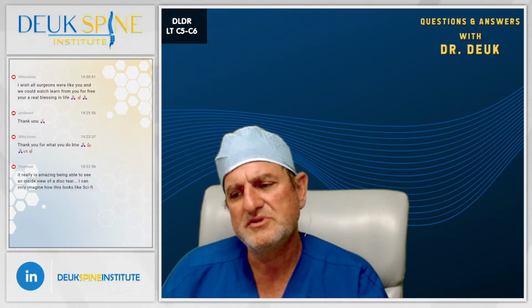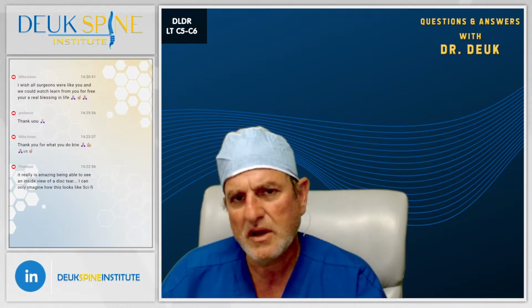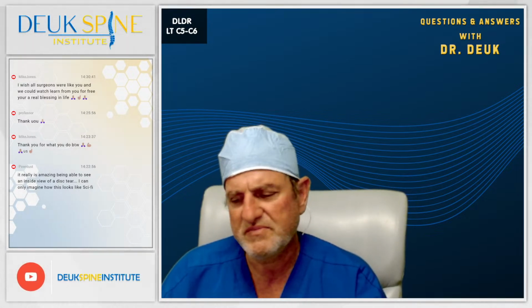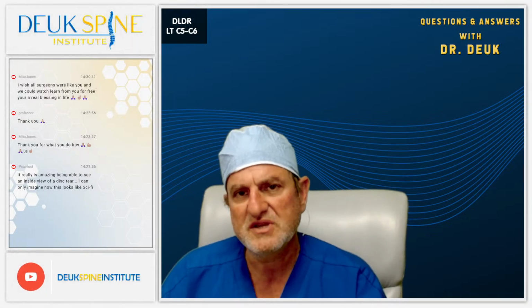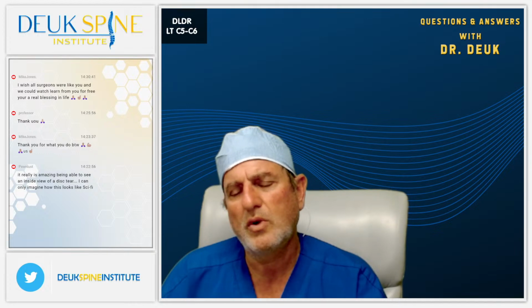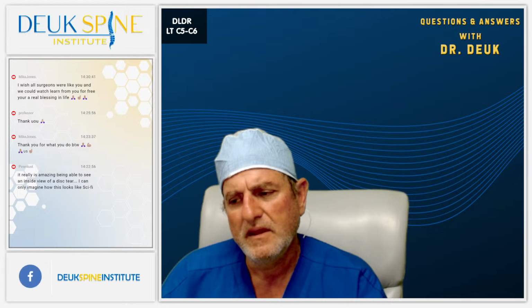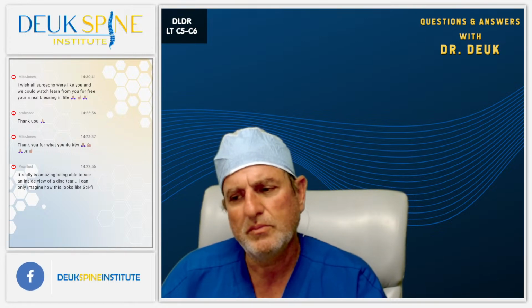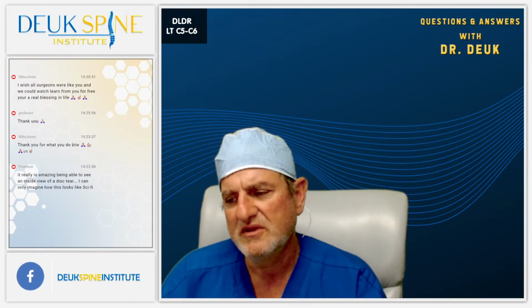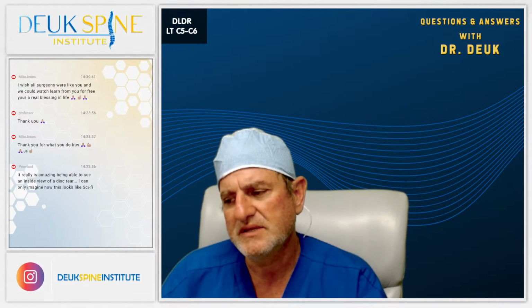Then the other thing I do is irrigate with diluted bacitracin, not full strength. Do not use full strength bacitracin. You will cause discitis yourself by putting it in there. So I use a dilute 1 in 10 bacitracin in sterile saline, and that will kill most bacteria, fungus, virus, anything that it could be. Usually it's bacterial, fungal, or protozoa, I guess, or TB.